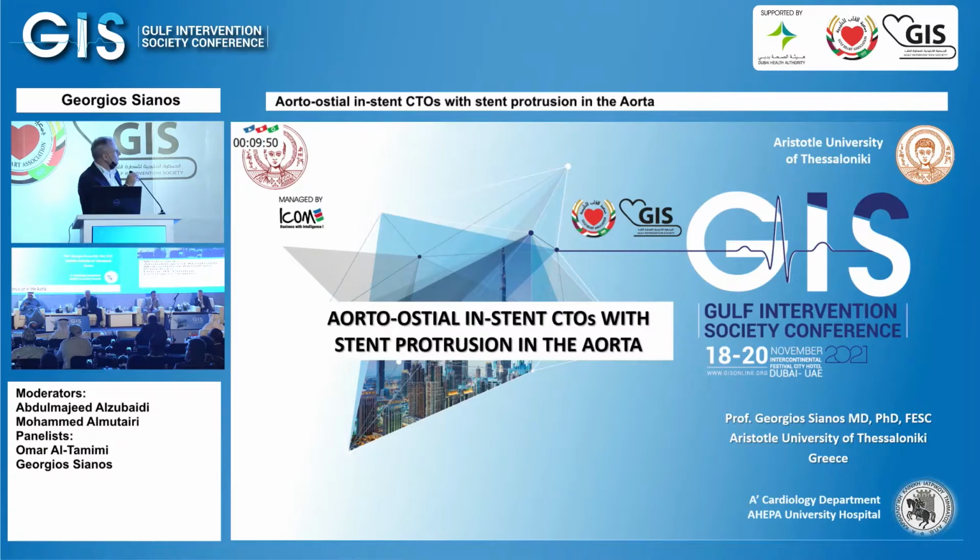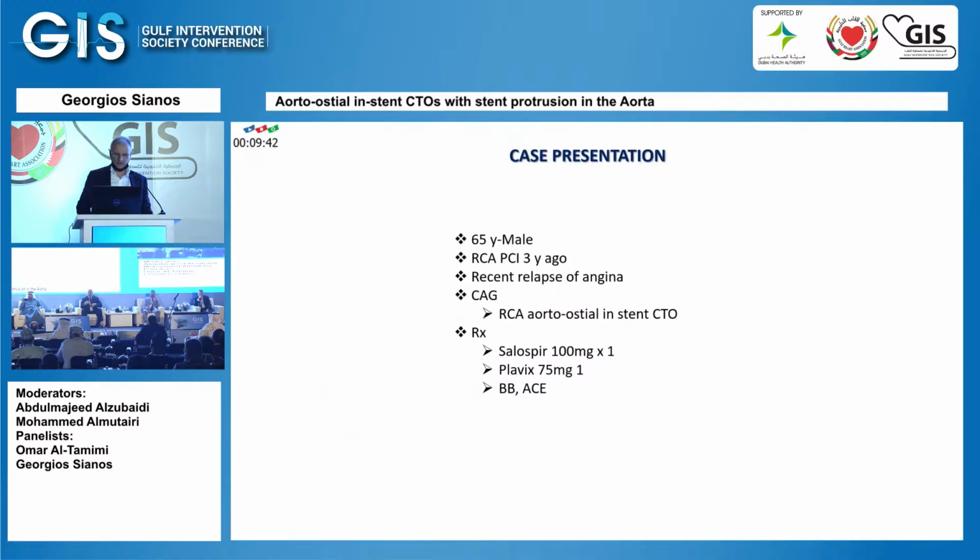To apologize, because this is not a complication case. I didn't realize that it was a complication session. So when I had a communication with Dr. Abdallah, because I have a book of complications, should that be necessary. But anyhow, I think I will present you something which is interesting: two cases of a kind of unusual scenario.